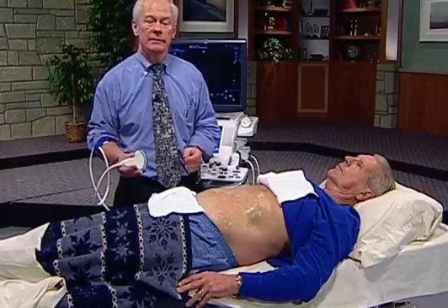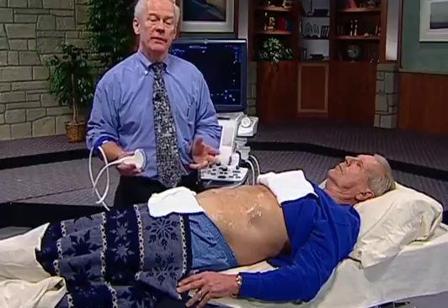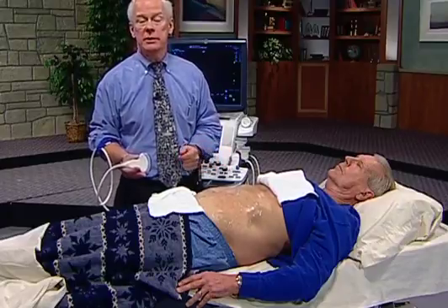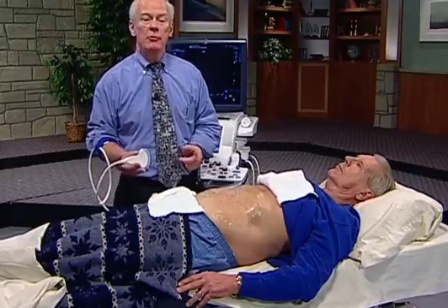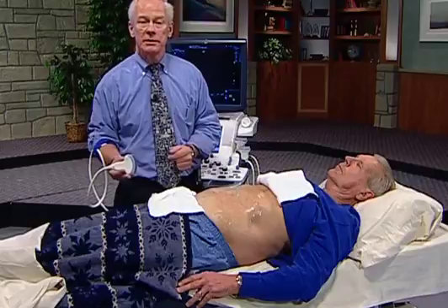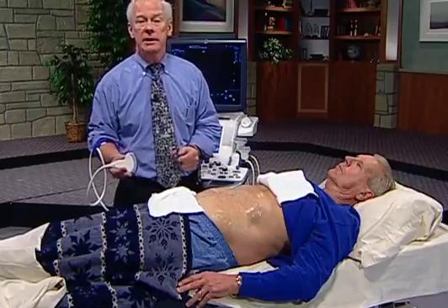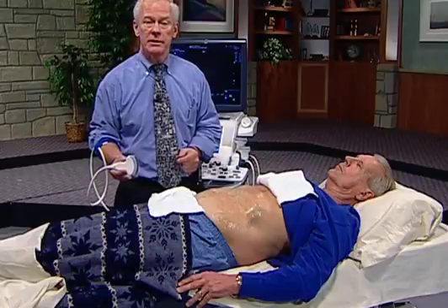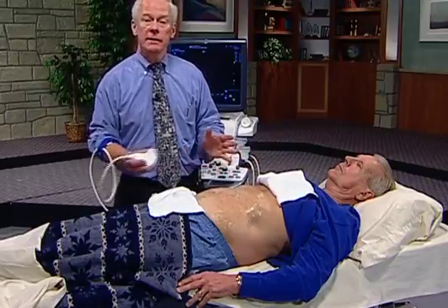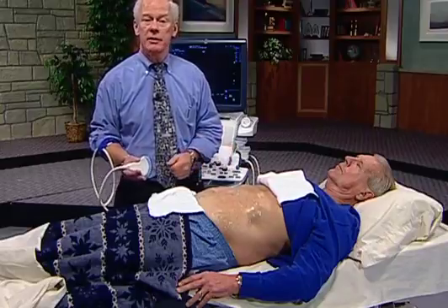Now, had this been an open repair of an aneurysm, we'd have done things very, very similar. The only difference would be there would not be a residual aneurysm left behind. We would be looking at just the graft structure itself, looking at the proximal and distal anastomoses. But our documentation in terms of anatomy and hemodynamics would be very, very similar. So we have been able to show you in brief a fairly comprehensive review of the aortoiliac examination, and I thank you for your attention.